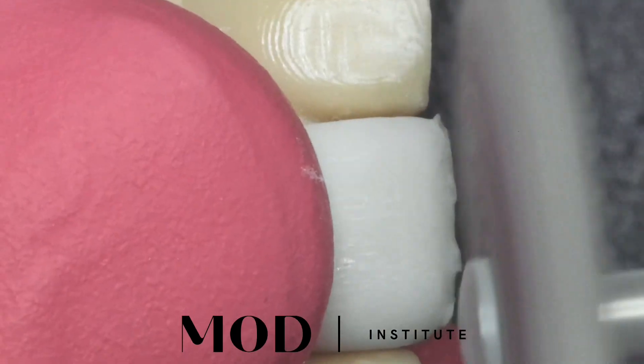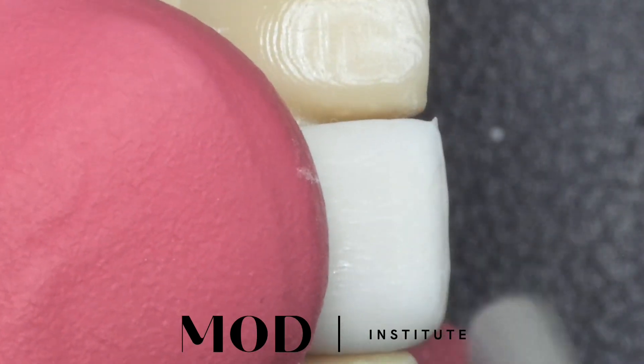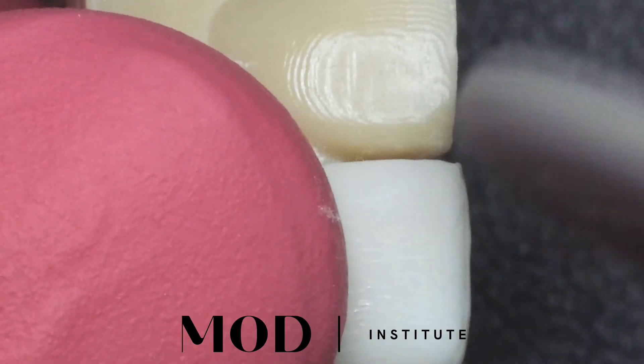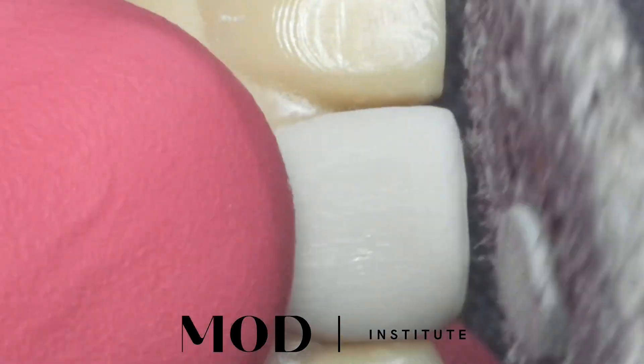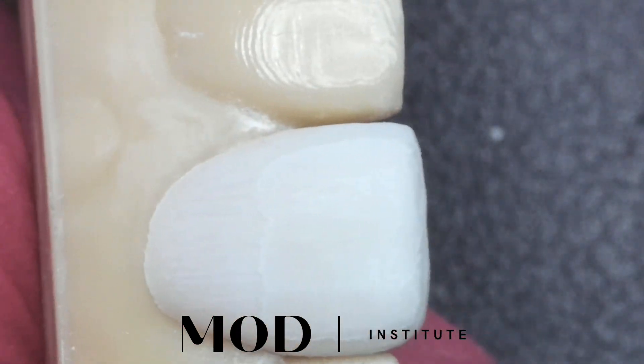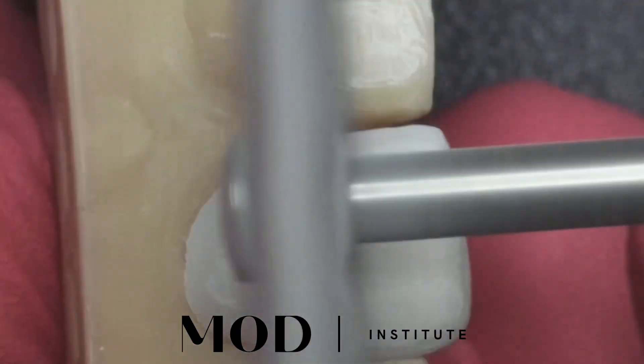This is actually the secret to the thin veneers. You're going to go ahead — preferentially on a model — and use that felt wheel, which is ultra gentle. You're going to take it from 300 microns down to about 100-150, wherever you want to go. You could go thinner than that even. Here I'm feathering out that margin to almost nothing.